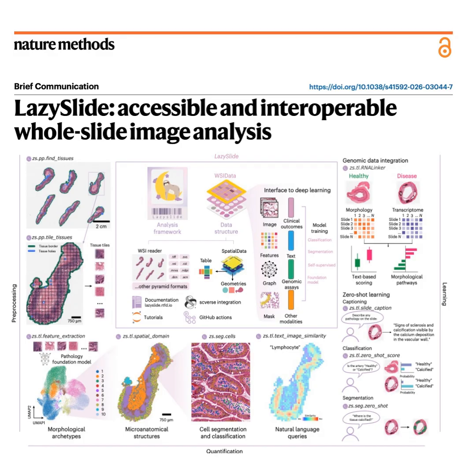Okay, so let's do a quick recap before I move on. Basically, whole slide images are massive, and existing tools force you to duplicate them, creating terrible data bloat. Right. But LazySlide uses WSIData to act as a lightweight pointer, reading the images without copying them, and it plugs right into the tools scientists already use.